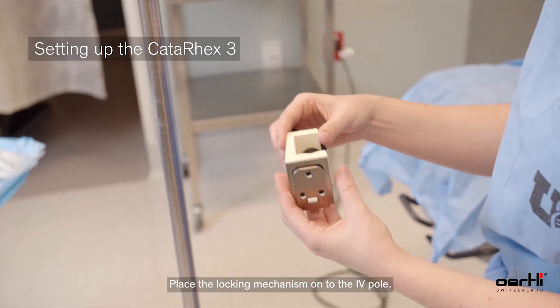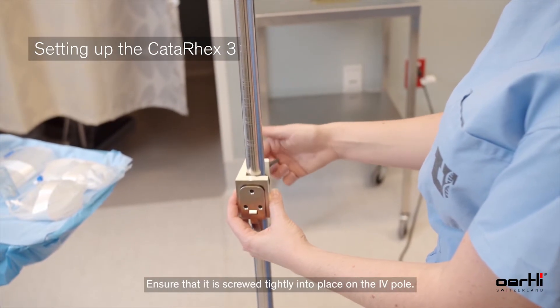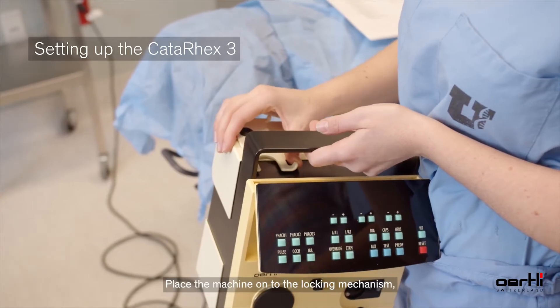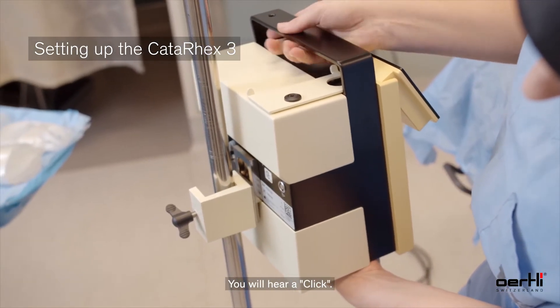To set up the device, place the locking mechanism onto the IV pole. Ensure that it is screwed tightly into place. Place the machine onto the locking mechanism, ensuring that it locks into place — you'll hear a click.